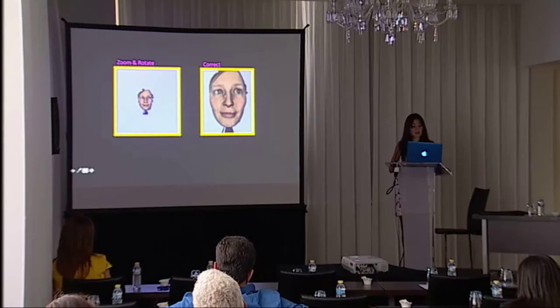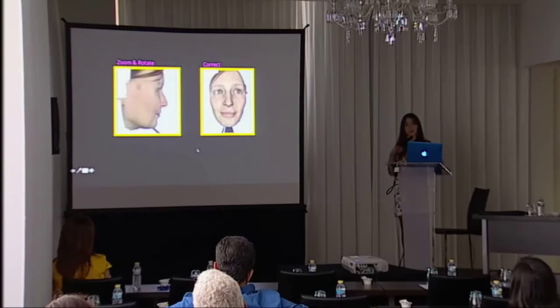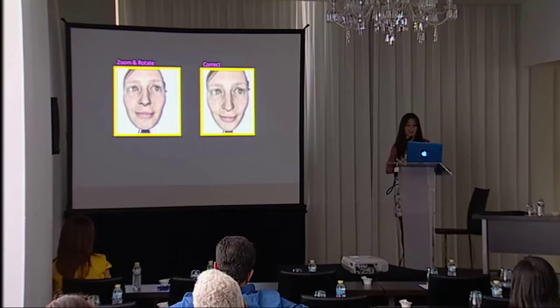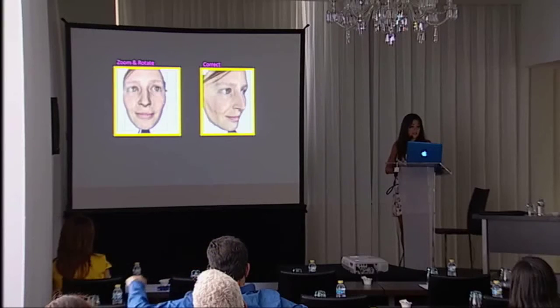So when using a 3D software, there's these advantages of being able to zoom in and out and rotate in 3 dimensions. Also, if placing landmarks, we can indefinitely place and remove the landmarks very easily.